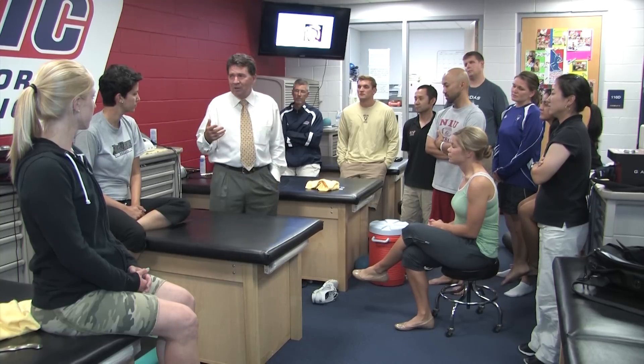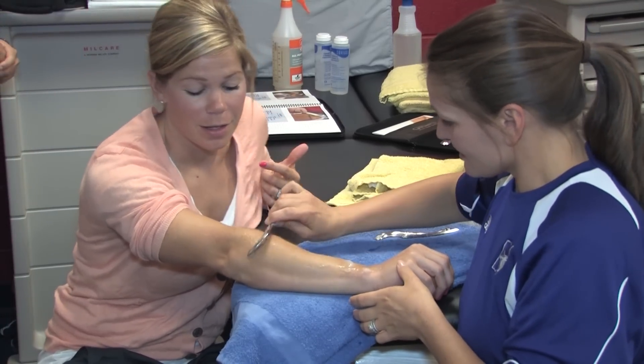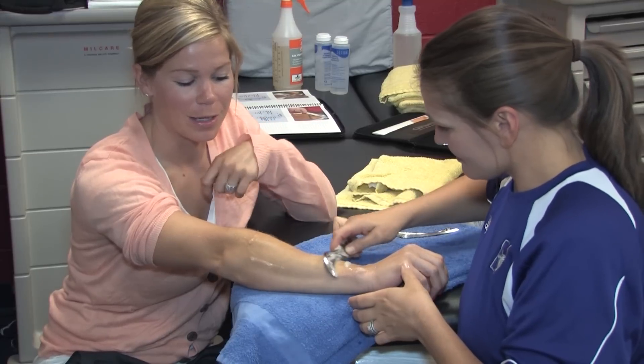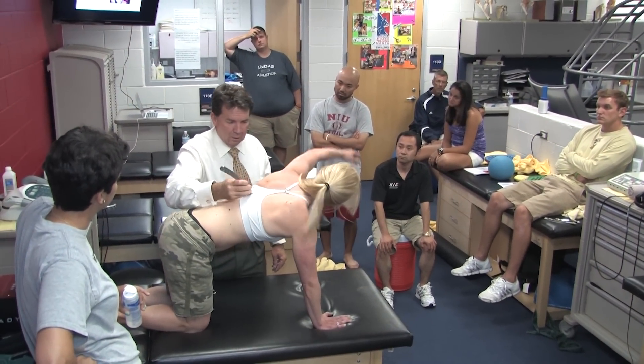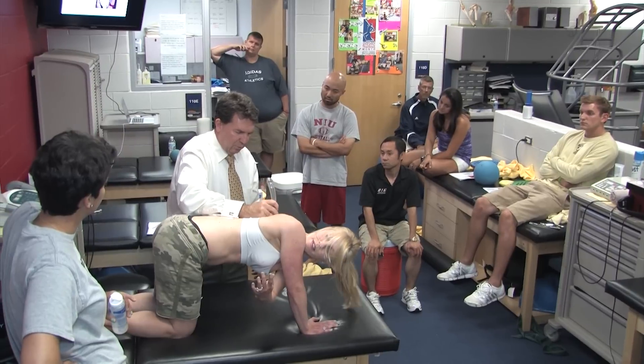Even when you think that the psoas is so deep. She is using the sweeping method and the GARA tool to work on lateral epicondylitis. I can use the end of the tool to do half turns between each vertebrae.